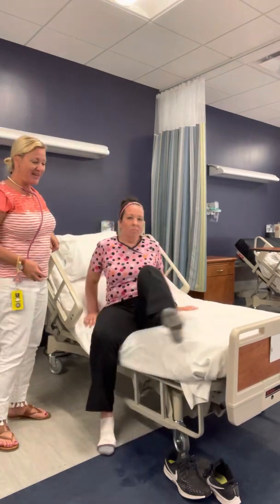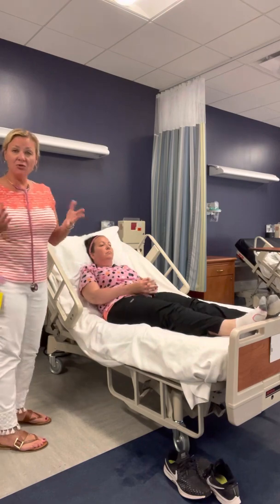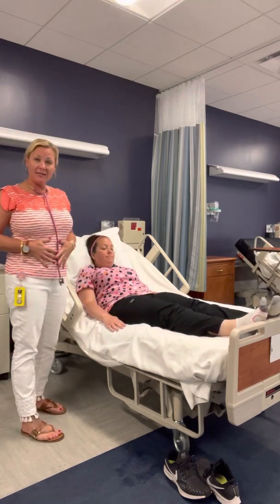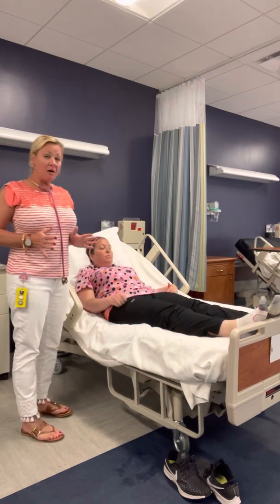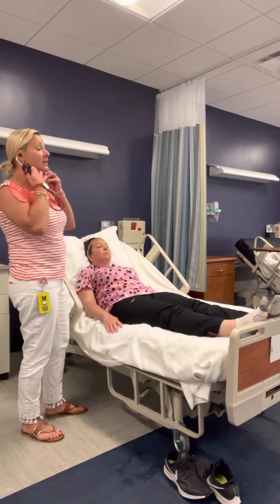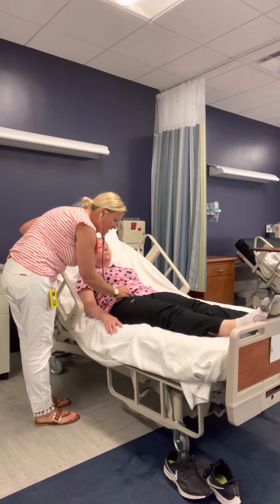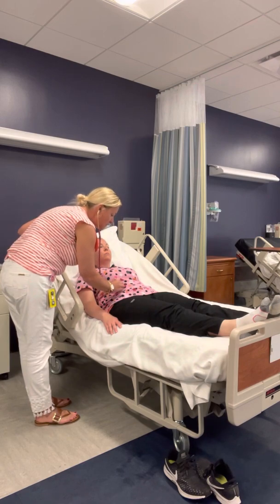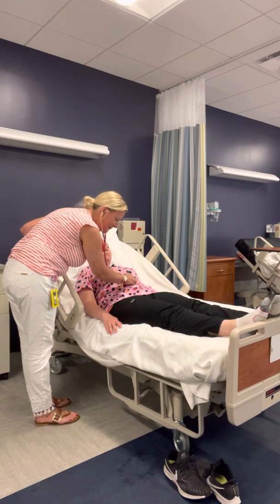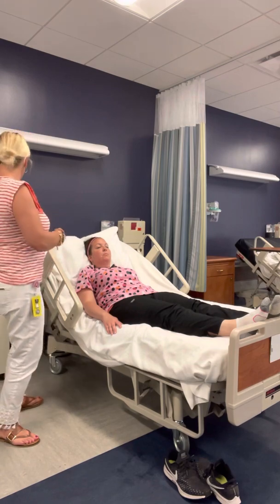Now I'm going to do the gastrointestinal assessment portion. So this is a short section for you guys. When I look at Professor Tate's abdomen, I see that it's symmetrical and the contour is nice and rounded. Now I'm going to listen with the diaphragm, and I'm going to listen to the right lower quadrant, right upper quadrant, left upper quadrant, and left lower quadrant. So bowel sounds are present in all 4 quadrants.